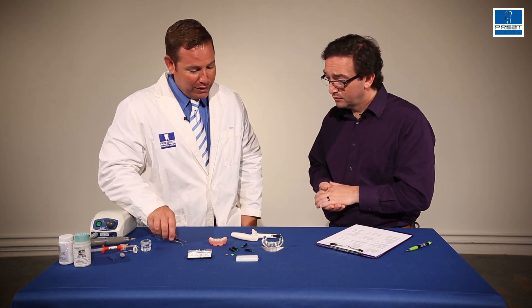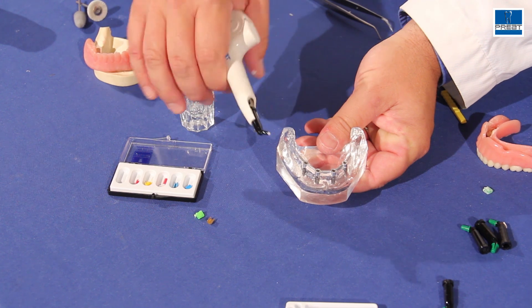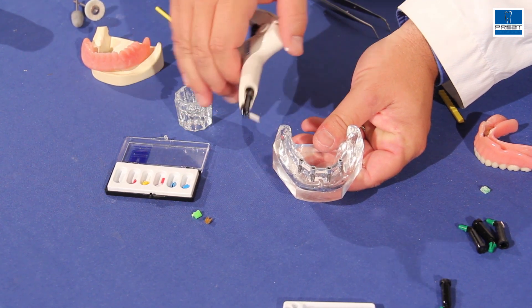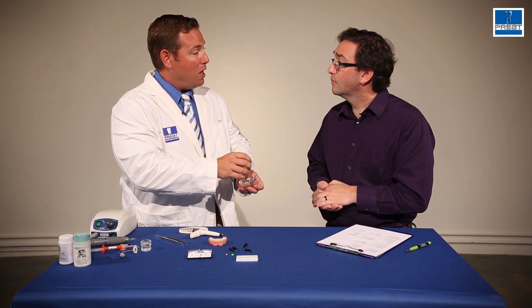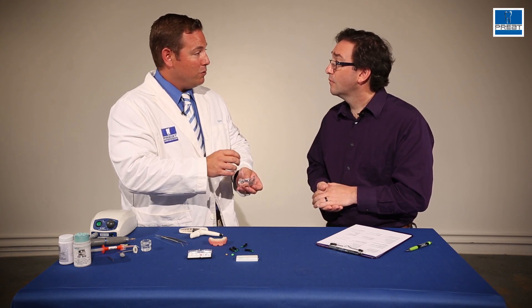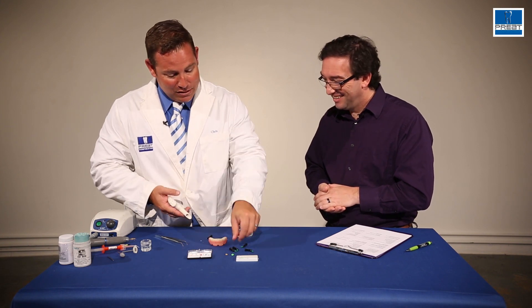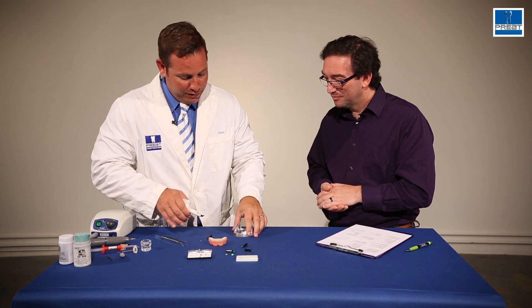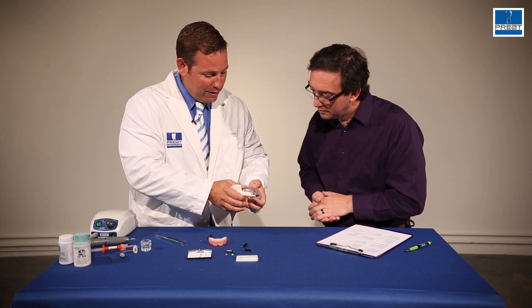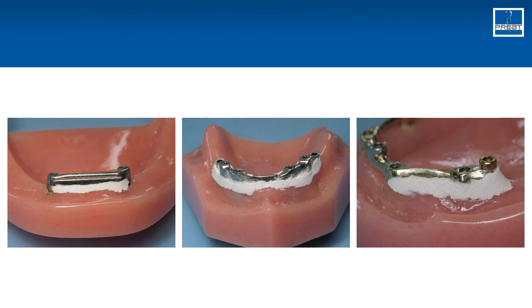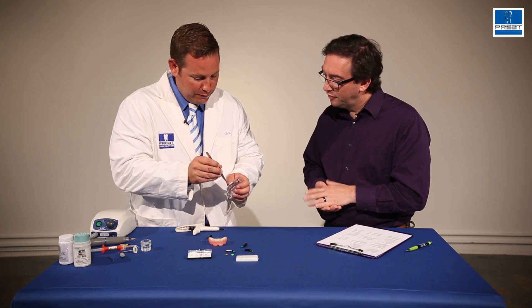So what we're going to do here today - the first thing we want to do is express out our blockout material. This is being done chairside because we want to eliminate any undercuts underneath the bar. If there's any undercuts where acrylic can sneak into, the prosthesis will lock into place, and there's no way to remove it besides drilling. This material is fantastic. The permablock works wonderful. It's non-water soluble, it holds in place, there's no setting time, no curing time. I'm going to express it out and push it into the undercuts.